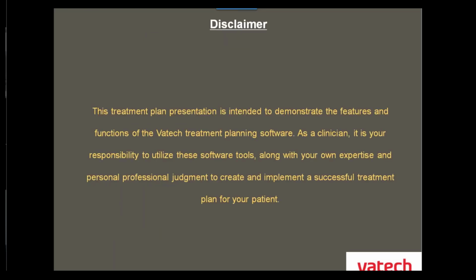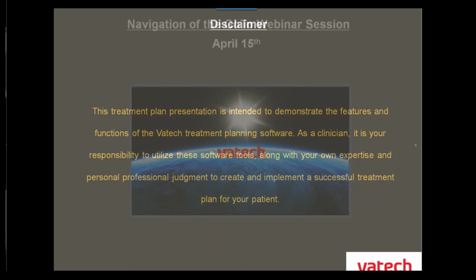This is a disclaimer. This treatment plan presentation is intended to demonstrate the features and functions of the Vatech treatment software. As a clinician, it's your responsibility to utilize these tools along with your own expertise and professional judgment to create and implement a successful treatment plan for your patients.